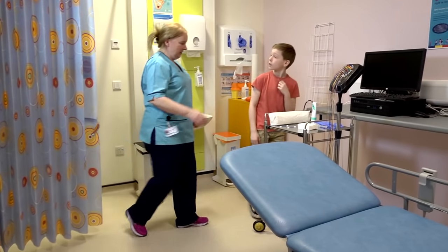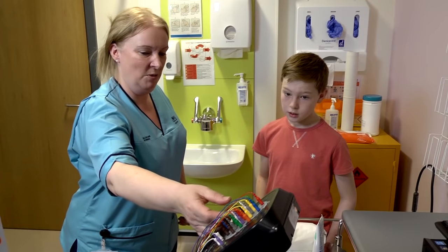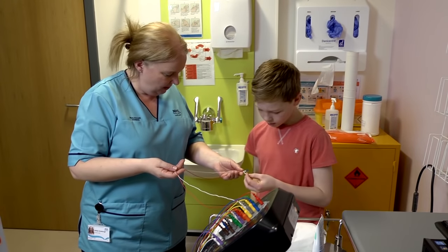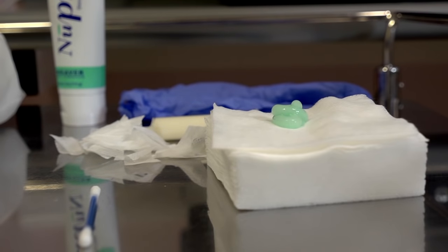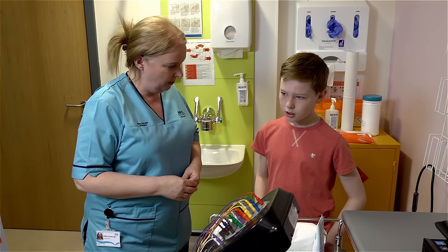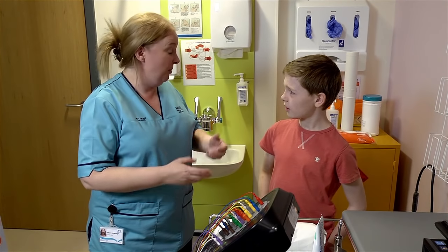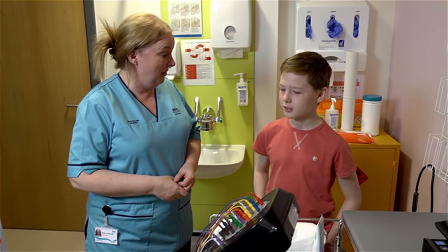Okay Robert, so I'll just explain to you what we're going to do here. I'm just going to put these little electrodes onto your head with some cream. Do you want to feel these? I'm going to pop them on with a little bit of gel, rub it with a cotton bud, and then pop on little blocks of cream and these just hold the leads on. The letter said I wasn't going to wear hair gel — why not? That can interfere with our brainwave recording and we want to get very good patterns.